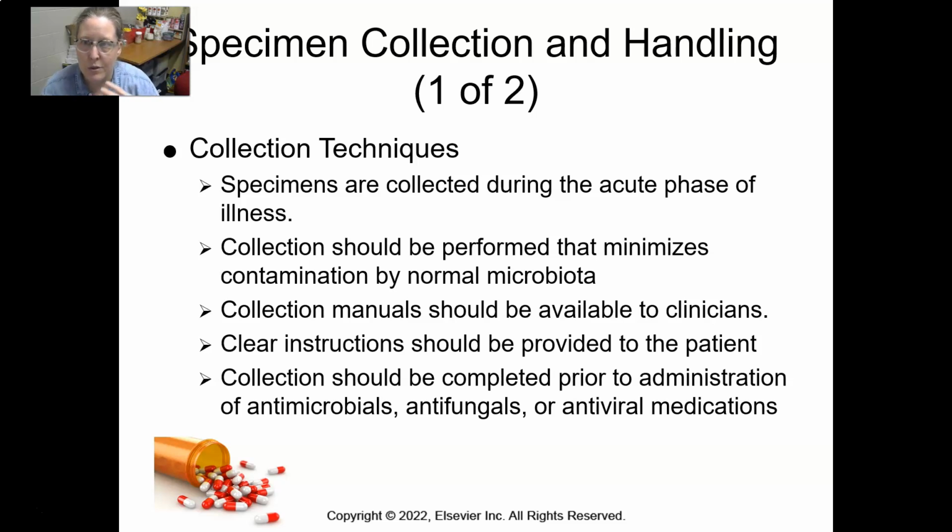Because of course, as soon as you start administering those and start treating the infection, you could reduce the likelihood of catching the microorganisms so you can properly identify them. And sometimes there are protocols. For example, for a patient that comes in with pneumonia in the emergency room, you need to collect blood cultures before they start the antibiotics. So sometimes they'll call for stat blood cultures, and it's not because they are in a hurry for the bacteria to grow. They're just in a hurry for you to collect them before they start the antibiotics.